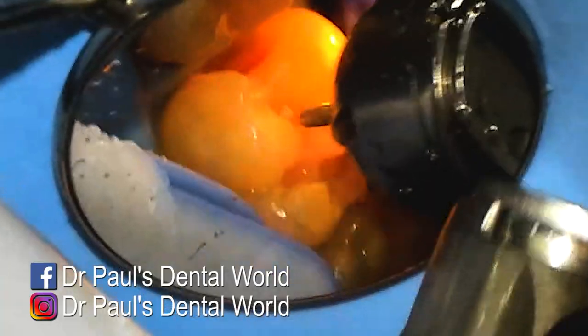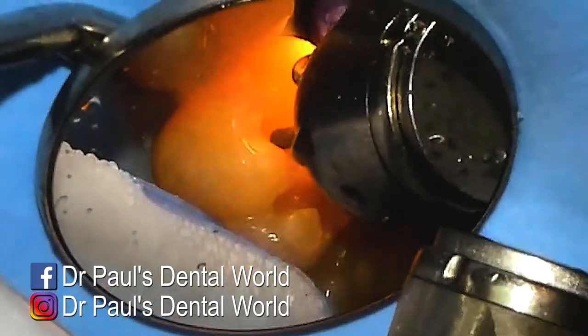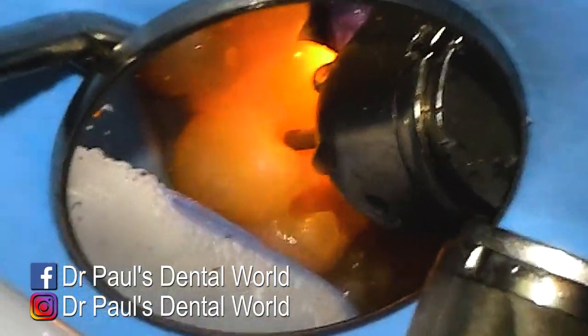Then in the middle, again you can see where it's chalky — I need to extend a little bit further in to get better access to clean it out with my high speed.